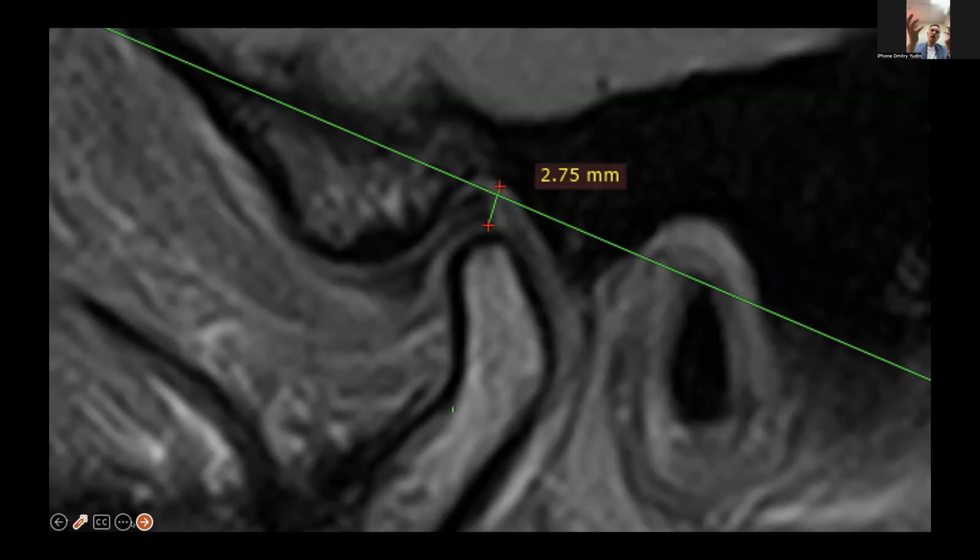When you put the model of the upper jaw on your articulator using the Frankfurt face bow and mount the model of the lower jaw in reference position, you can find in your articulator the same position as in the MRI of your patient, in your hand in the clinic. Then you can use this articulator and move down, left, and forward, and create those positions.